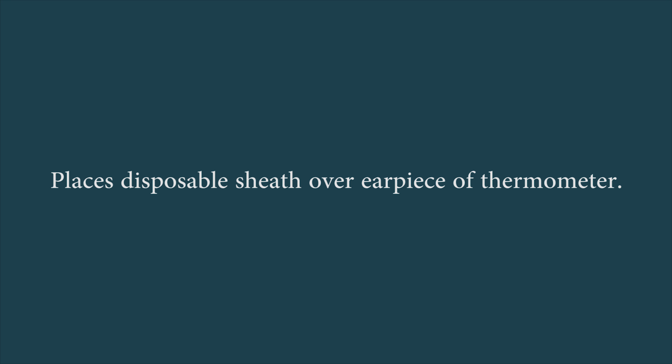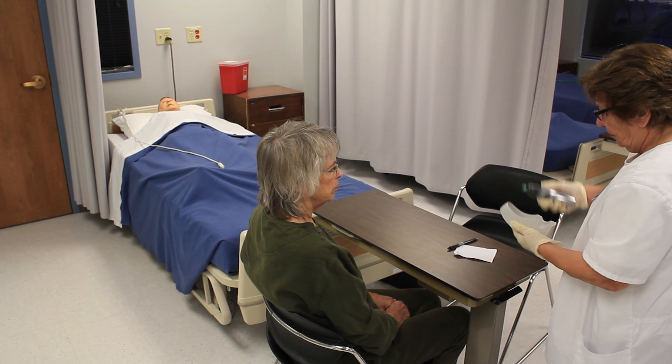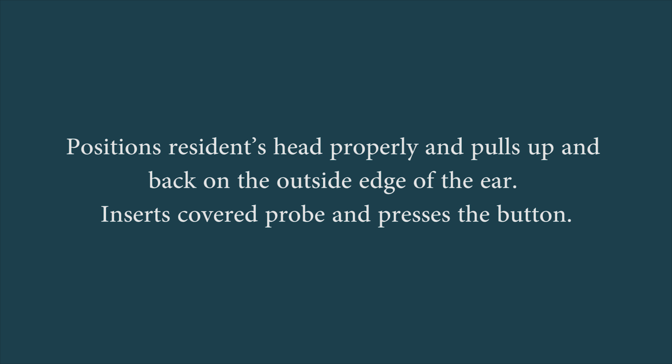Places disposable sheath over earpiece of the thermometer, positions the resident's head properly, and pulls up and back on the outer edge of the ear, inserts the covered probe, and presses the button.